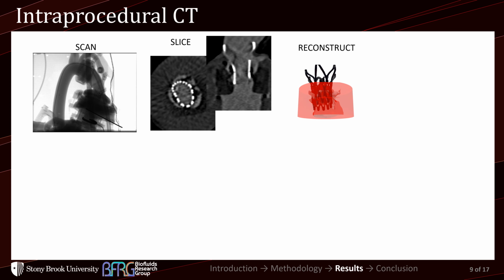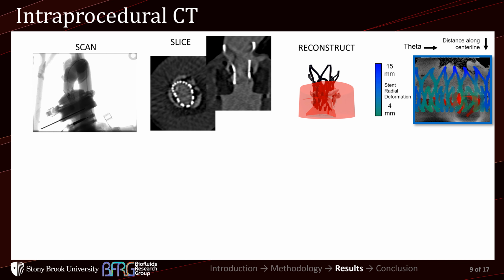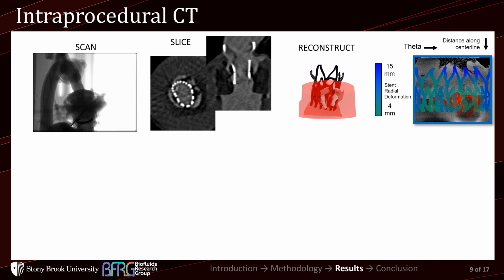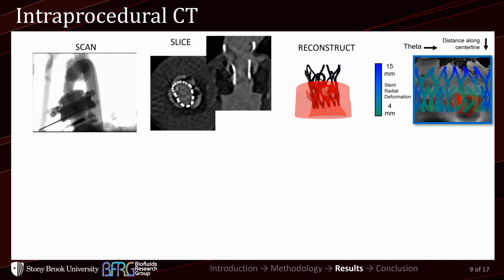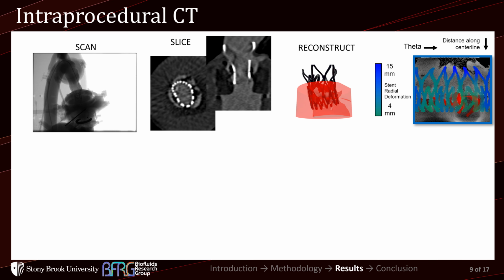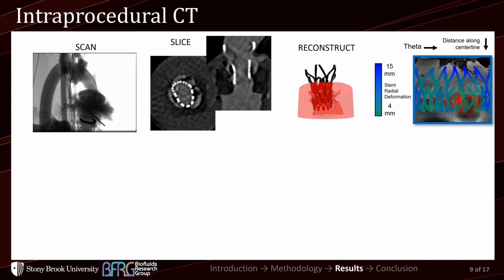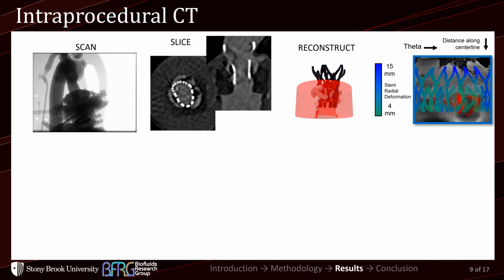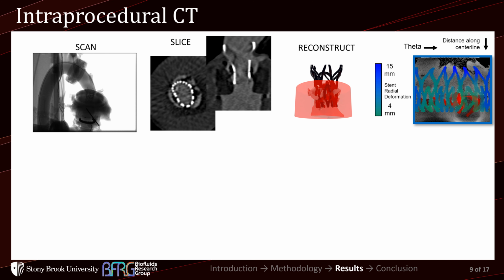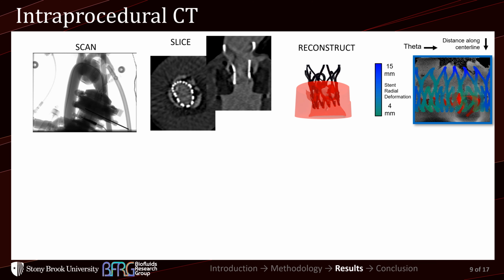and where it aligns inside of the lumen. This gives us the ability to reconstruct the stent and actually measure its deformation, and we can correlate that to the performance characteristics, showing that the variation in the Polynova performance is directly linked to the variation in the stent. From a design standpoint, we can go back and say that the stent geometry needs to be refined in order to have a more consistent deployment against these patient-specific anatomies.